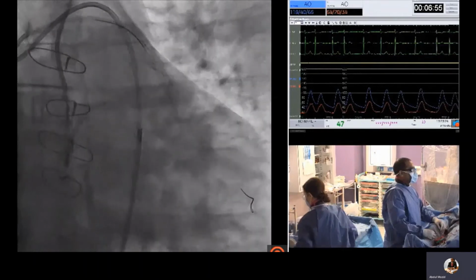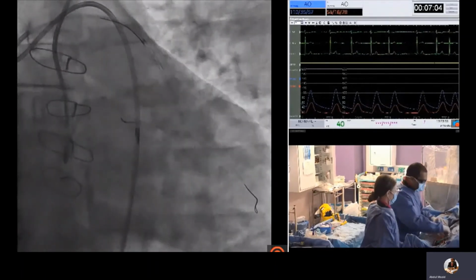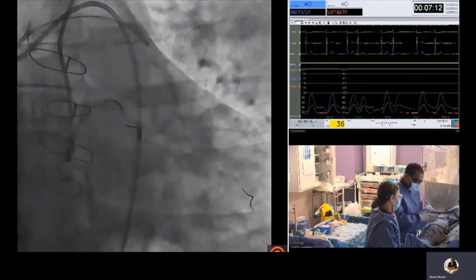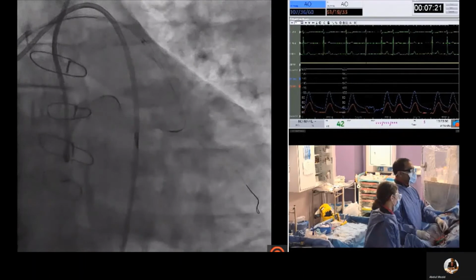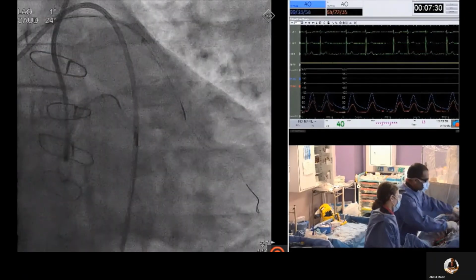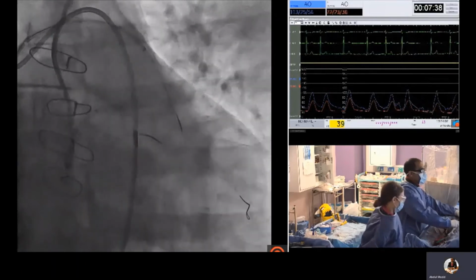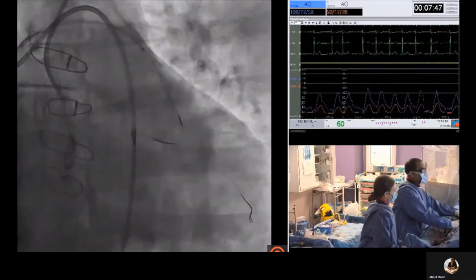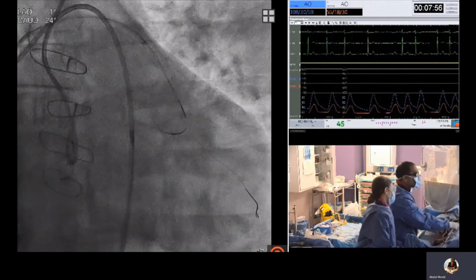So with the wire advanced far up the body of the microcatheter, retrograde microcatheter, the retrograde Turnpike LP is then slowly removed, and at the same time follow this with the antegrade microcatheter, which was a regular Turnpike here. And you are able to torque the antegrade Turnpike all the way around, following the retrograde microcatheter. We've now crossed the occluded segment.